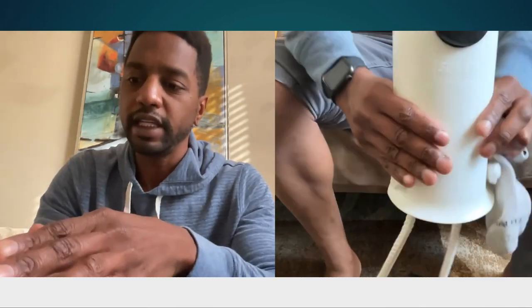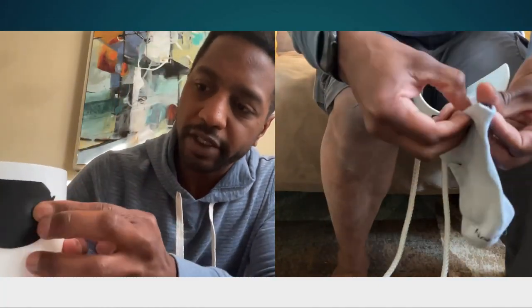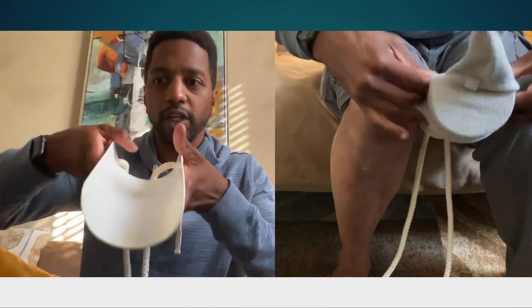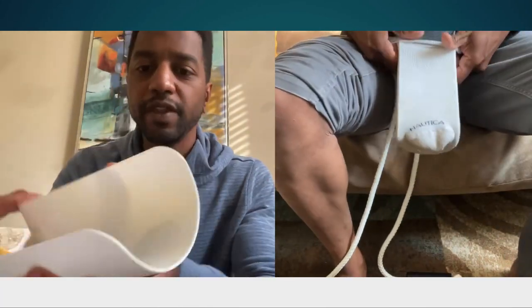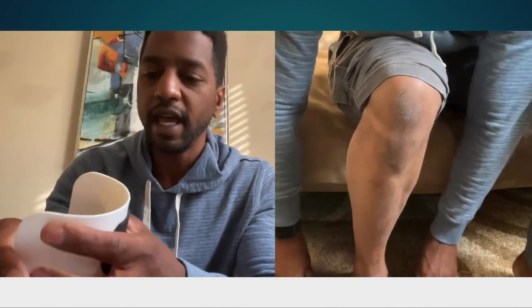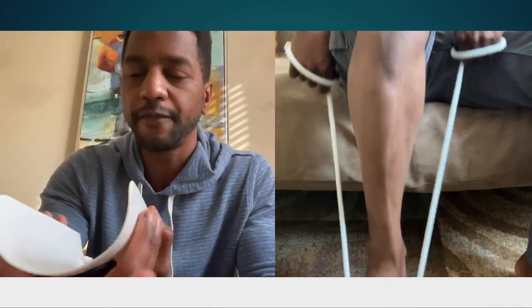I really like the non-slip surface on the back here. It's a foam material and it will help to prevent the sock from sliding off as someone's pulling the sock on. This is pretty much almost like a PVC pipe that's cut in half — it's very malleable but yet will keep the sock firmly on there.